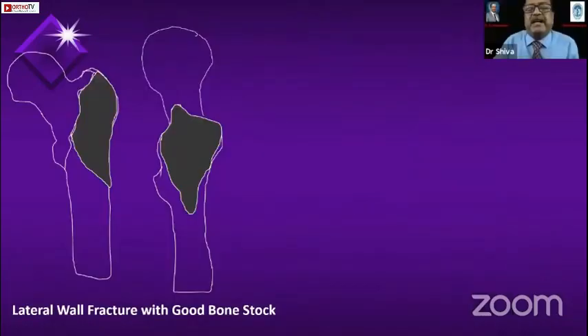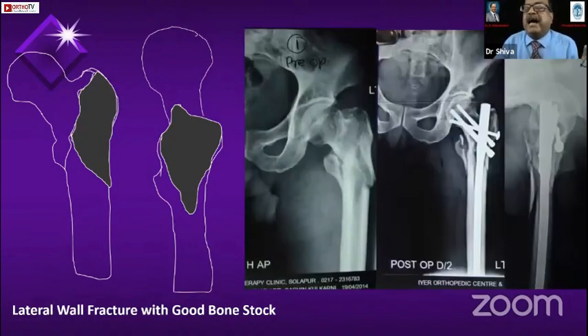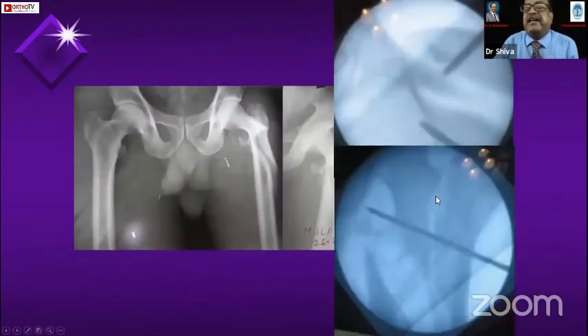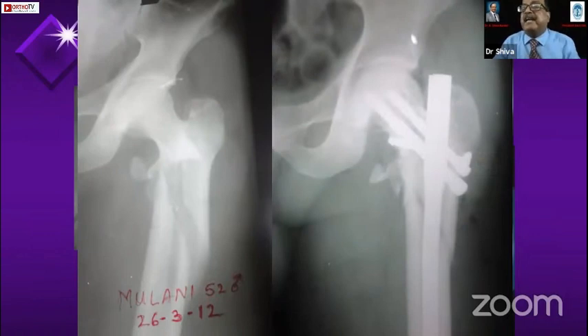When the lateral wall is large and the bone quality is good — not osteoporotic — in a young patient with a good lateral wall, I would tend to fix it, because if I don't fix the lateral wall the nail can toggle. For that purpose I put this screw here. In another case, similarly, I held the reduction first, then passed a cancellous screw, converting this intertrochanteric-with-subtrochanteric fracture into a pure subtrochanteric fracture, and then did the nailing. This is where I fix the lateral wall.